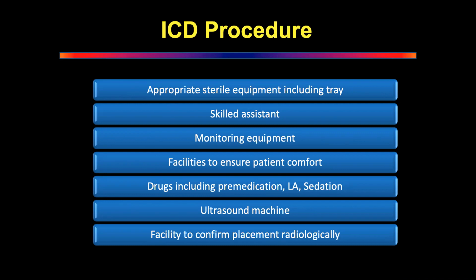Now tell me all about the sizes of chest drains that you know of. Choosing the size depends on the pathology, or the cause for which we are putting the chest drain. If it is a simple pneumothorax, then we don't need to use large chest drains. If we are doing it for empyema or effusion, then it is better to use larger chest drains. Give me numbers. This is the FRCS exam, so we're not talking in general. Give me what size for a simple pneumothorax.